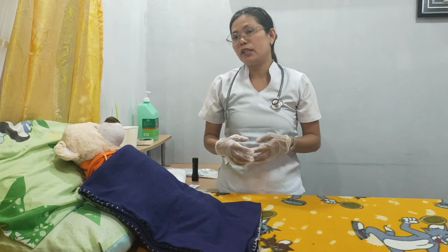Cover the patient's chest with towel or pad. This is to prevent from making any mess, then explain the procedure and make sure to develop any appropriate hand signals or gestures.